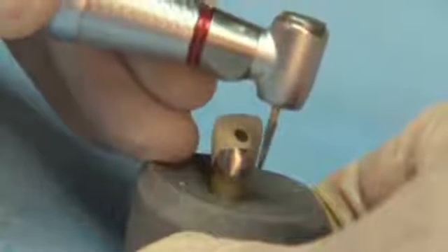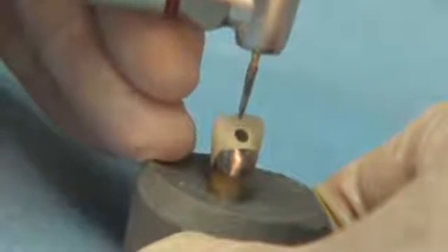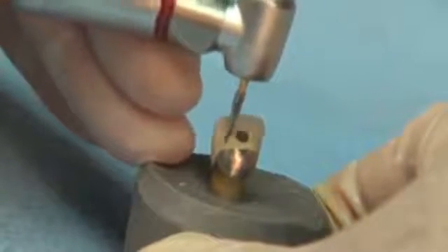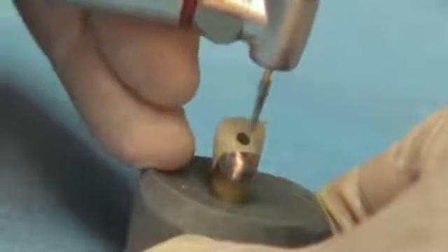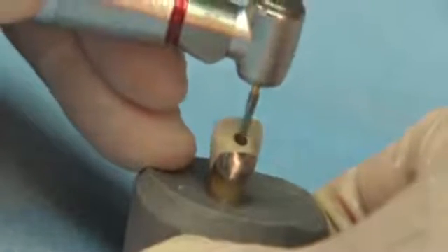After initial endodontic access has been created using the Great White series of burrs, the EndoSafe End Instrument can be introduced into the tooth. EndoSafe End Instruments are available in two sizes, 1.4 mm and 1.8 mm.